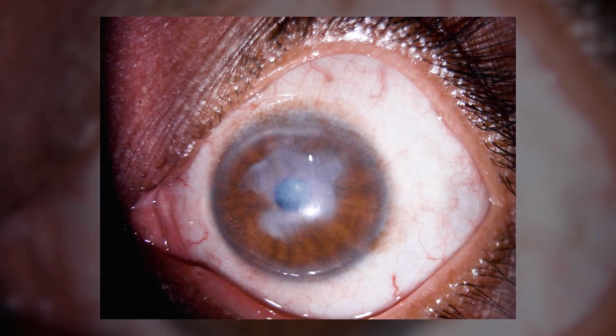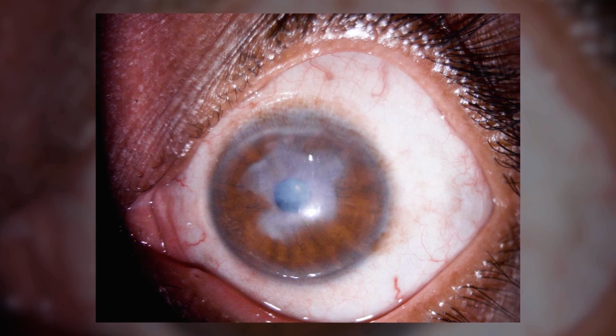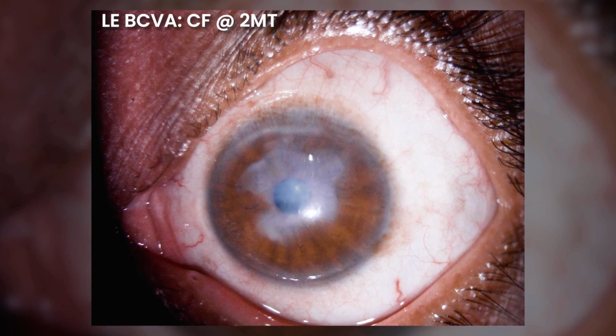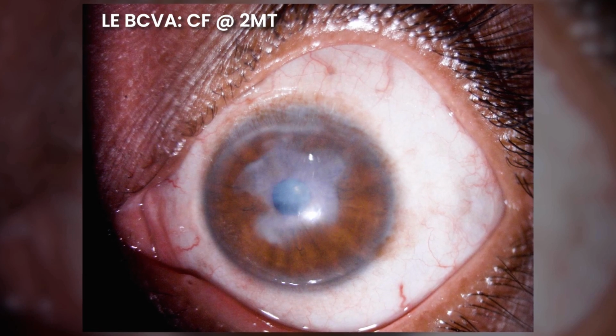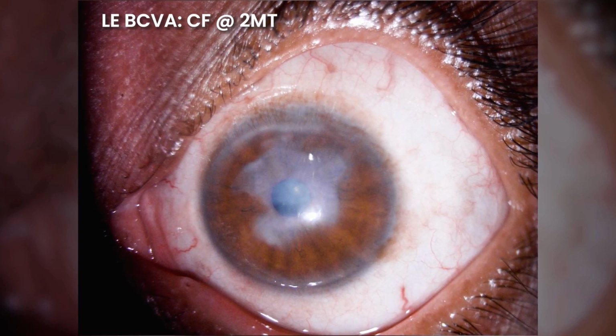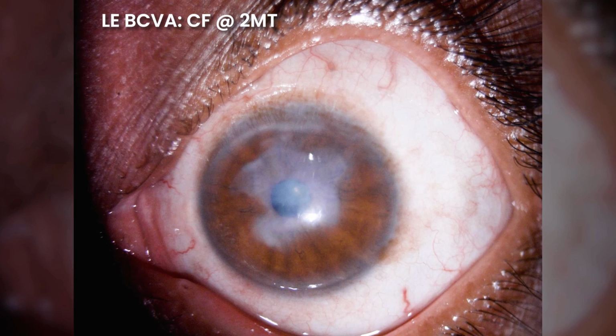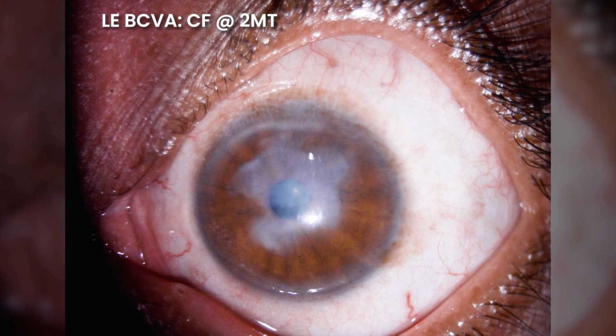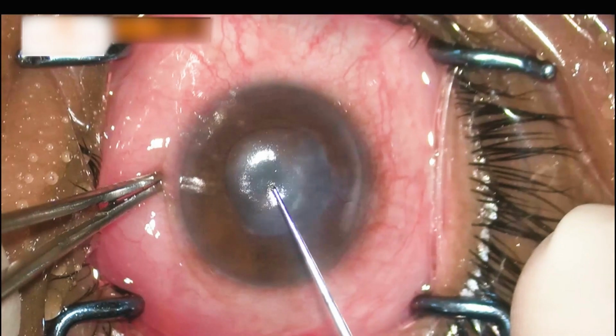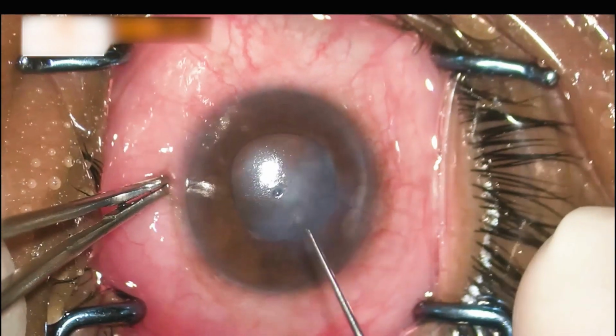Now, this was a case of a 45-year-old female with best corrected visual acuity of counting fingers at 2 meters in the left eye, diagnosed with left eye nebular macular corneal opacity, status post healed fungal ulcer. The opacity measured 6 by 5 mm and was involving the visual axis. DALK was planned in this case.